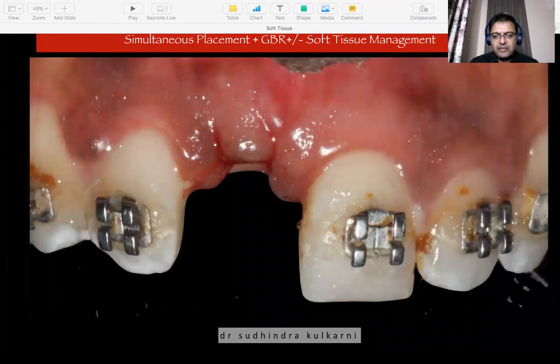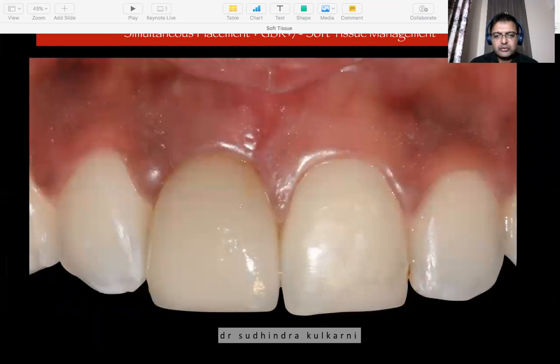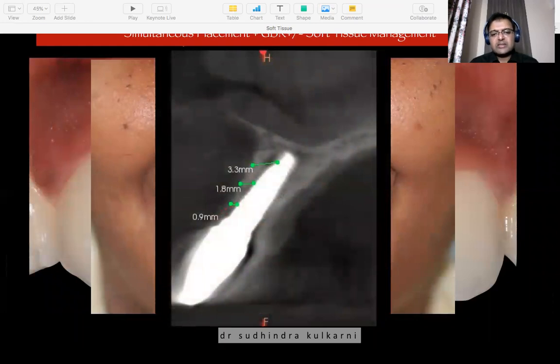When the patient comes back for uncovering 3 months down the line, what we see is this: temporize, and as you temporize, allow the tissues to heal down, and then you put your final restoration. You can see that even at the time of final restoration, you see two thin, fine scar lines, and I'm expecting that these would eventually settle down over some amount of time for the patient. What I'm happy with is the amount of bone that I have around this dental implant. I'm pretty sure that this would eventually hold up.